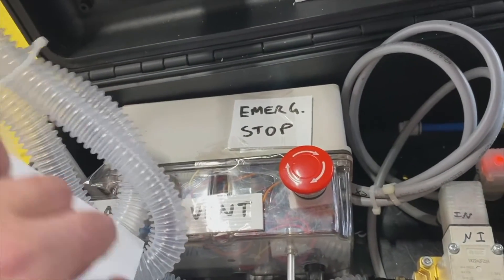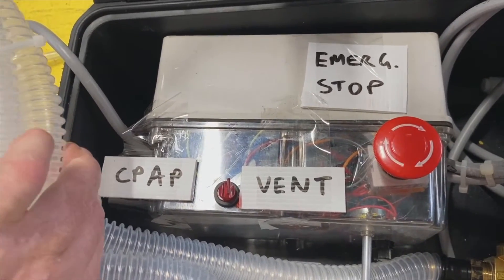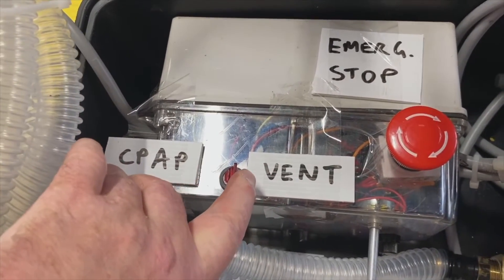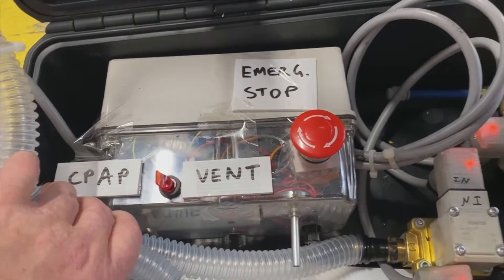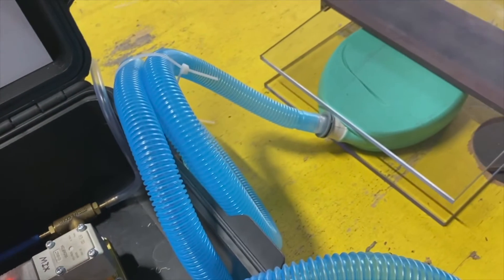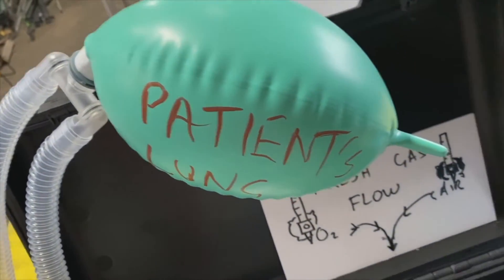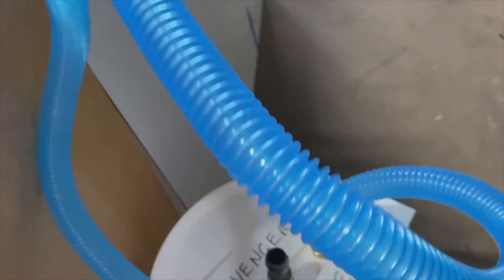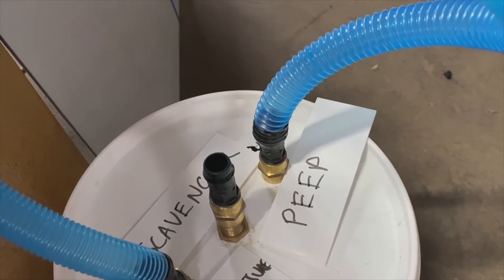We've got a little switch here that can switch from ventilator mode to CPAP mode. When you flick across to CPAP with a flick of the switch, it opens up all the valves so the system is completely open. The bellows are no longer ventilating, but the pressure is maintained — around about 10 centimetres of PEEP. So if your patient was breathing, this might be a way of delivering just a standard CPAP circuit.